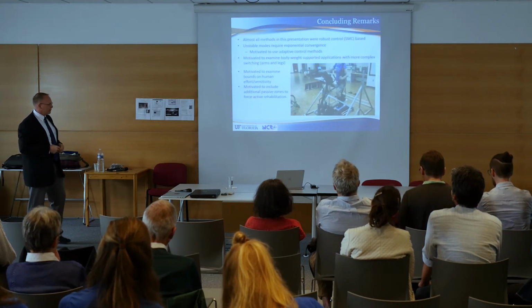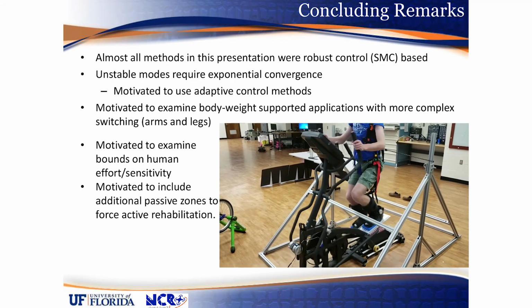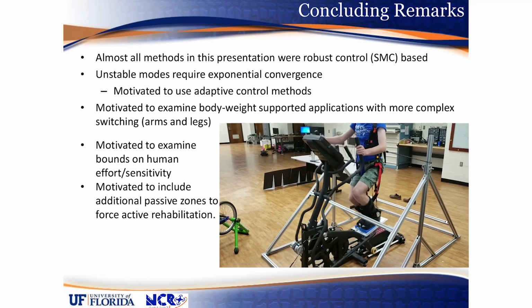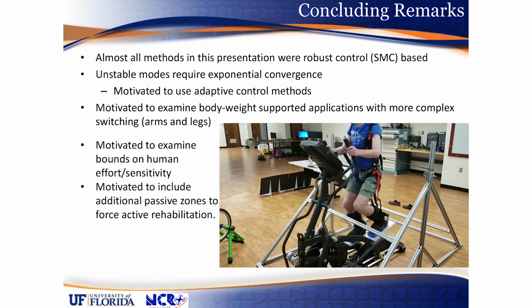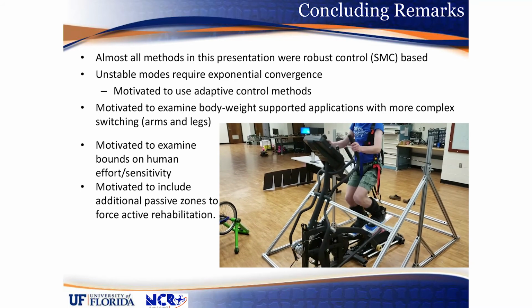And then in conclusion, we are now working on experiments with an elliptical walker, which is essentially cycling but horizontally, using upper body and lower body. We're also extending our early work in compensating for delays towards cycling, because each muscle group has its own delay characteristic, and each muscle group comes on at different times throughout the cycle. So the delays that the muscles are experiencing throughout the crank cycle are varying all over the place.